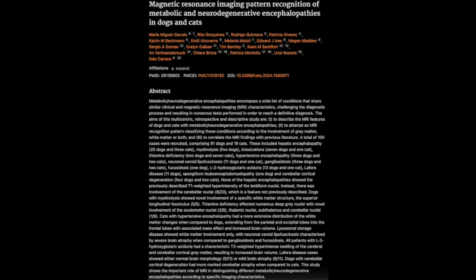Speaking of tailoring our approach, I was really impressed by that flow chart they developed, the one for MRI pattern recognition. Oh yeah, figure 14, that's a really practical tool. It is. It kind of simplifies things, breaks it down into those key features, brain volume and lesion distribution. Right. It helps you narrow down the possibilities, kind of like a decision tree. Exactly. So if you see increased brain volume, you might be dealing with something like an intoxication or L2-HGA. Or feline hypertensive encephalopathy. Right. And if you see isolated cerebellar atrophy, well, that pretty much points you toward cerebellar cortical degeneration.